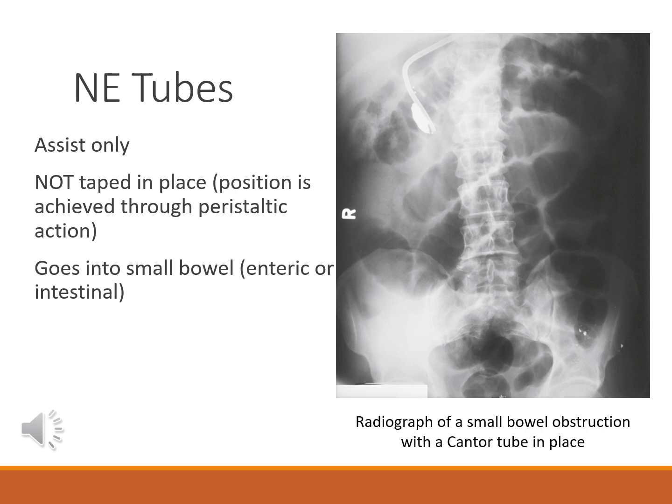Before administering medication, food, water, or contrast agents through an NG or an NE tube, its correct placement must be confirmed using X-ray. Failure to verify the tube's position could result in administering substances into the pleural cavity, which can lead to serious complications. Initially, the placement of an NG or NE tube can be checked with an image, plain film X-ray, or a fluoroscopy. However, it's not practical to use radiographs every time tube placement needs to be verified.